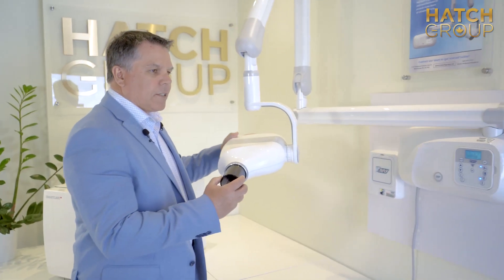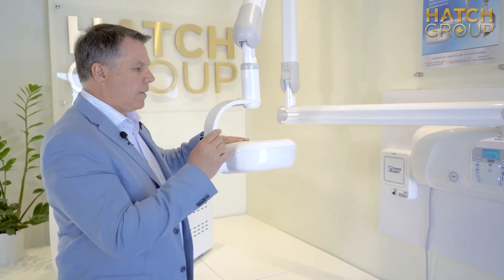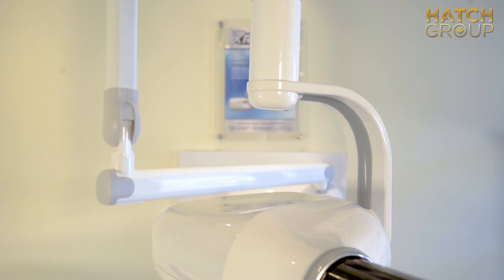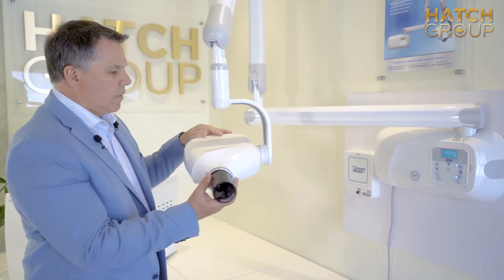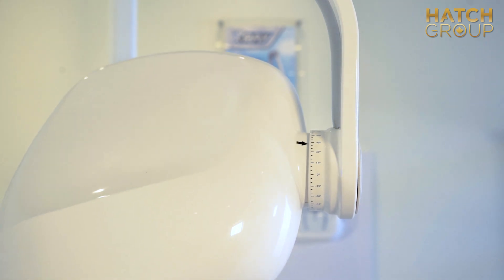Another great feature is the 540-degree rotation of the tube head. It's a lot easier to make high-quality X-ray images with the rotation at 540 degrees. Also, for those occlusal X-rays, you have great range of motion vertically as well.